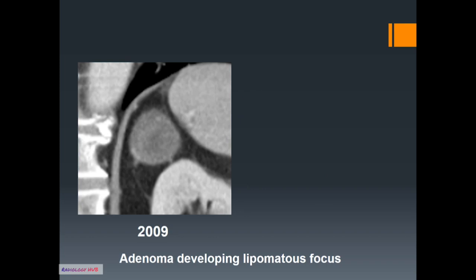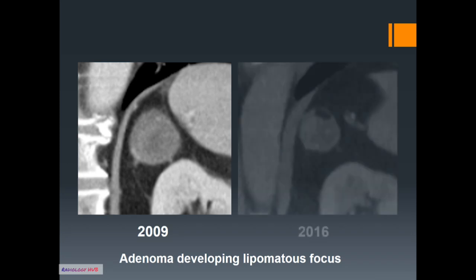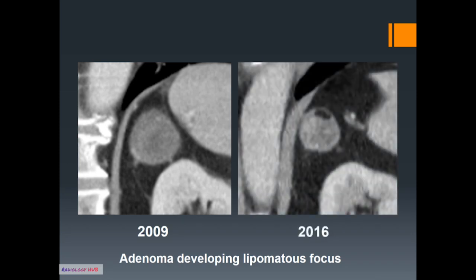This is a case of a proven adrenal adenoma that in 2009 was entirely soft tissue density. However, the patient came back for a CT for an unrelated reason seven years later and had developed a small focus of macroscopic fat within the tumor.